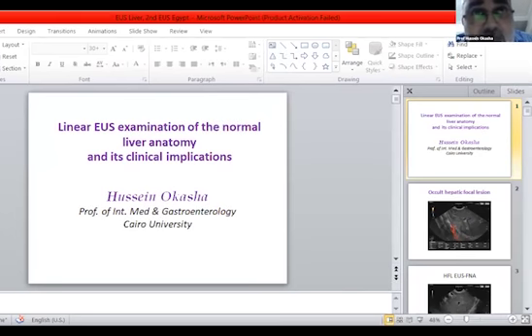And we missed many lesions by EUS of about 2 centimeters. It is a large lesion. Why? Because it is located in segment 5 and 6. So I agree with you that isoechoic lesions are difficult to visualize, but the most difficulty is the site of the mass in segments 5 and 6, and not the size or the texture of the mass. I hope that I can give you a clear answer. That's perfect.